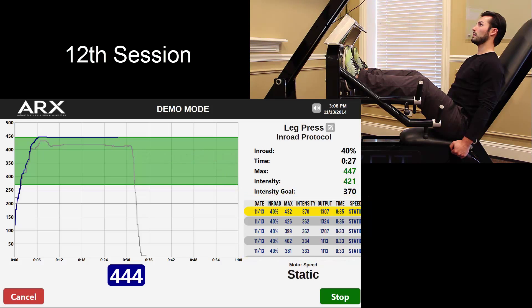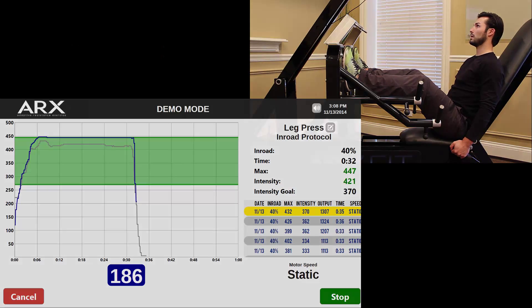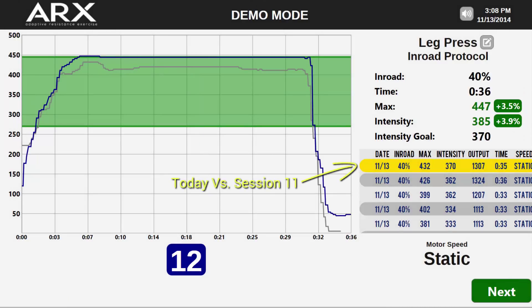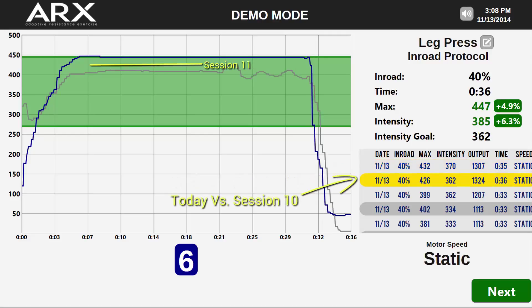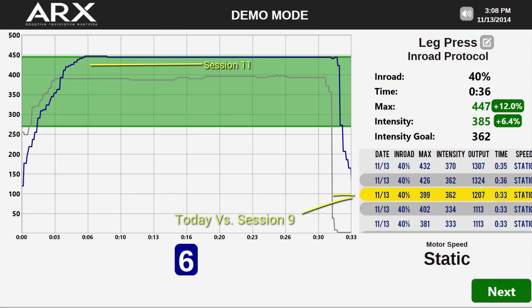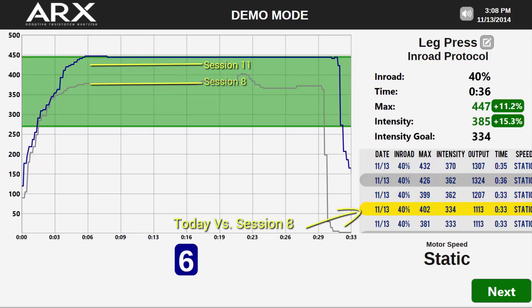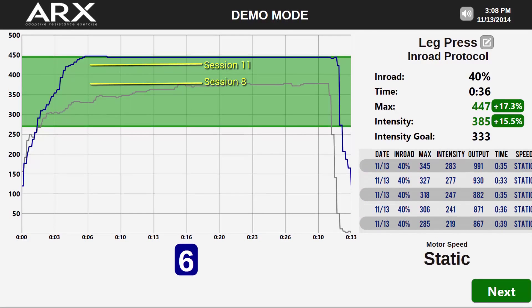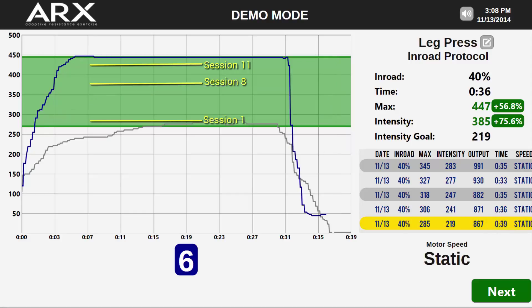He finishes this session and is compared in real-time to a previous session, just as always. As he finishes, his improvement is again displayed visually and by percentages to the right. But watch what happens as we begin to compare him not just to the previous session, but the session before that, and the one before that — notice the gray line moving lower and lower as he compares sessions from further and further back in time. It paints a different picture. And as we scroll all the way back to his first session, a much clearer picture emerges of exactly what kind of progress this patient has made in his 12 sessions of rehab.